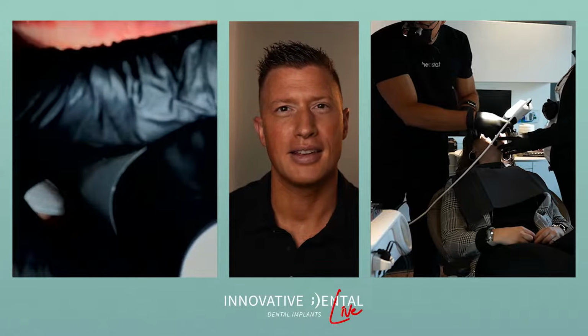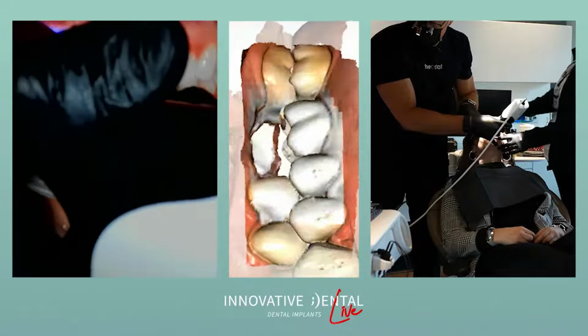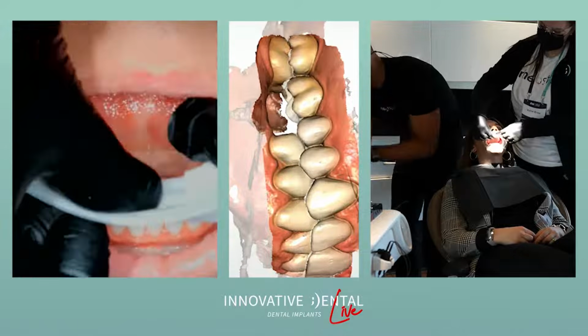So there we are, going to take a bite. So she's biting all the way down, and that way when we make this implant crown, she's not going to have issues with biting together and having it messing her up, going side to side, and finding that she's colliding too soon on our implant crown.